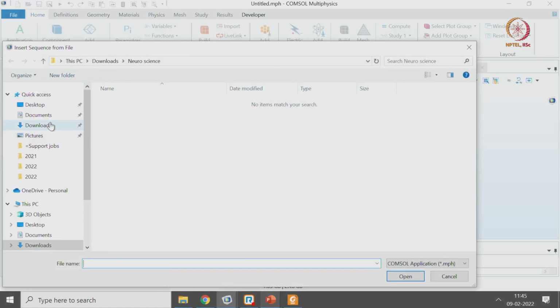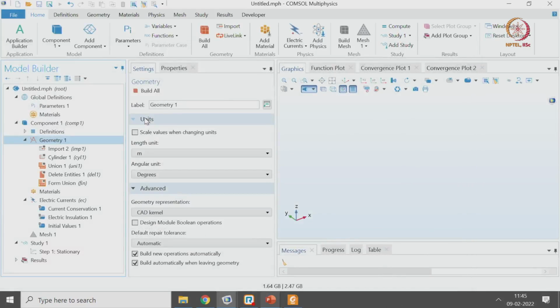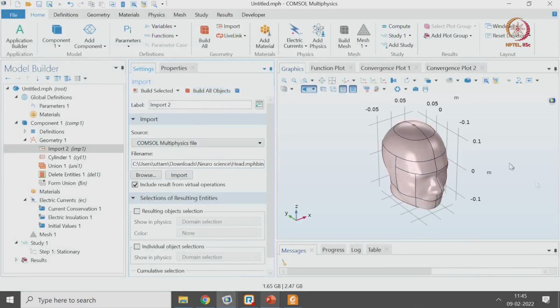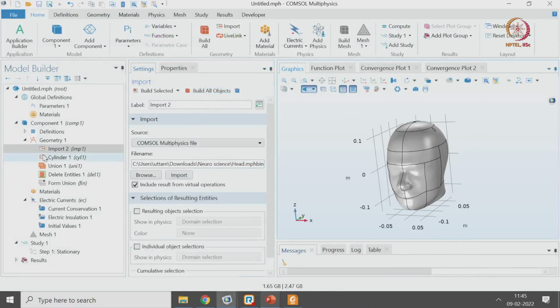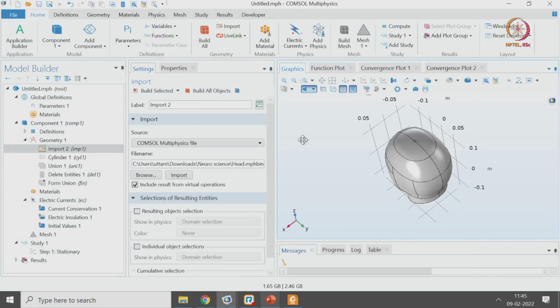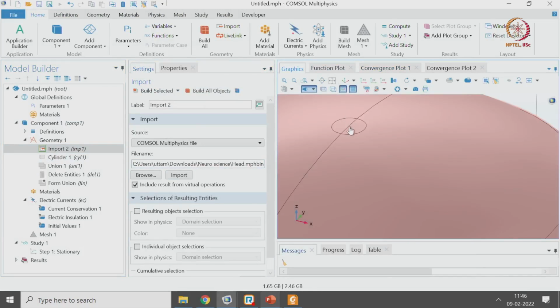This structure could also be available easily if you just search in some of the CAD free sources. Such kind of structure of the upper part of the body are easily available. The next is to also import the head body. So this is the head part. This is the first thing I start with, importing the structure of the head. So you can see this is the structure of the head, and then this ground is already there over here.